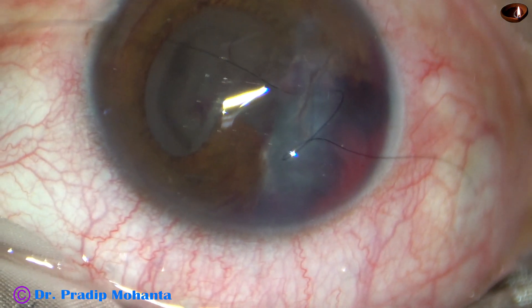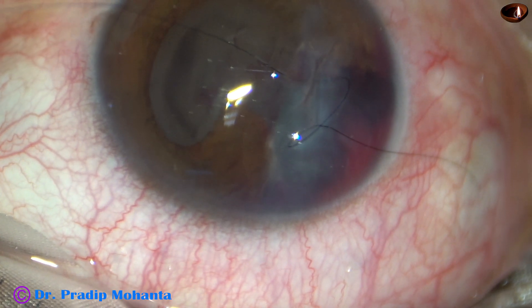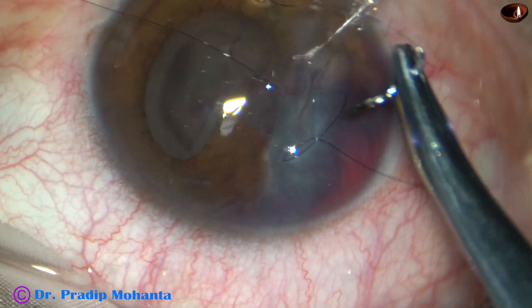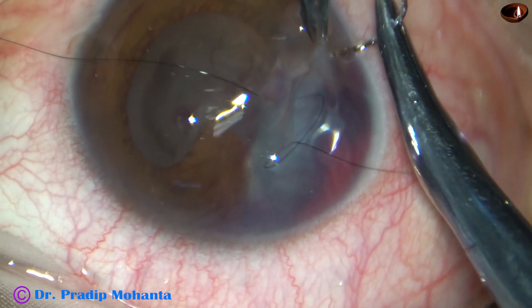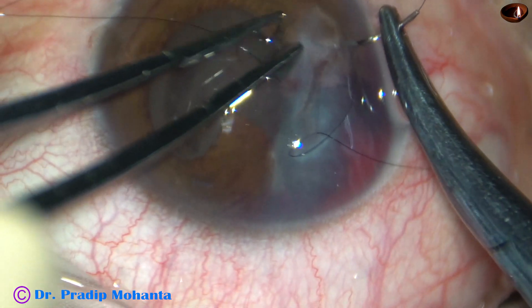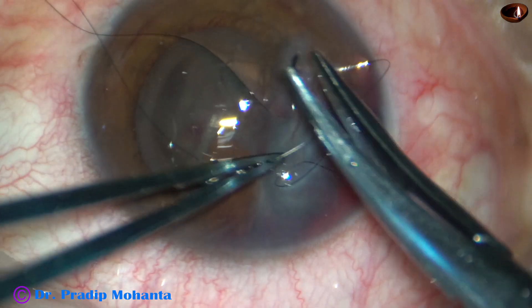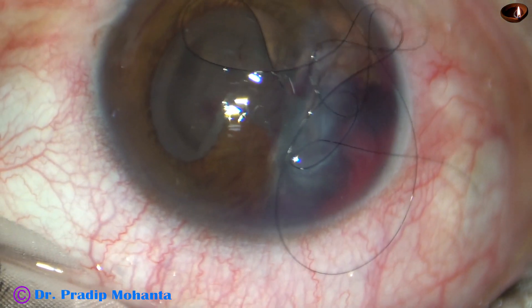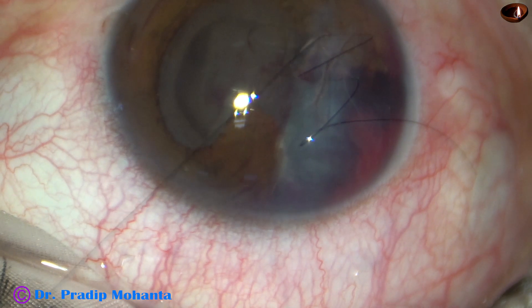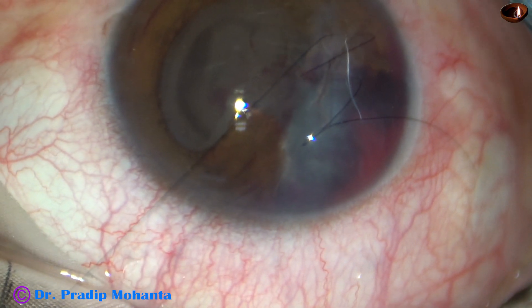We can put interrupted sutures, but whenever we put interrupted sutures, the tensile strength or tension of the interrupted sutures should be almost equal — one suture should not be tight and another loose. The continuous shoelace suture has the advantage that in a short time, the opposition will be very good, with no tight or loose sutures. It is a continuous, single-strength suture all around.